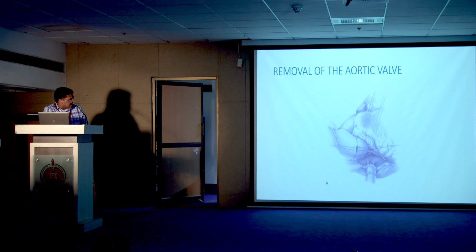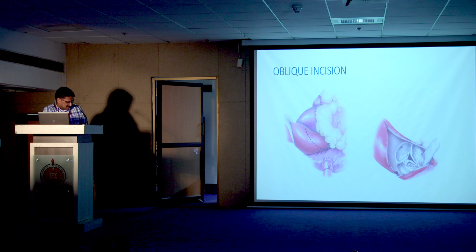Beware, this incision should start 10 mm before the origin of the non-coronary sinus. Otherwise, it's difficult to close this aorta when you have completed the aortic valve replacement.